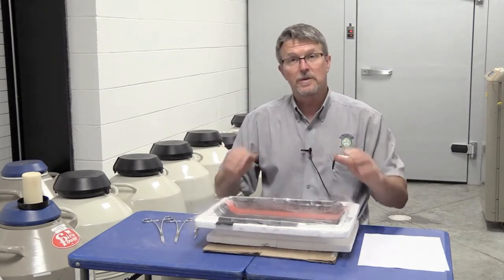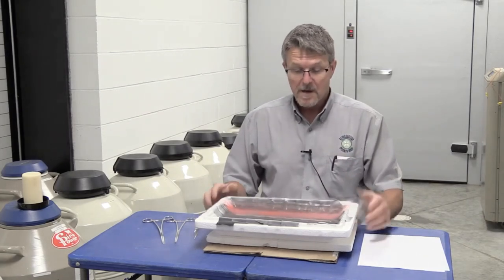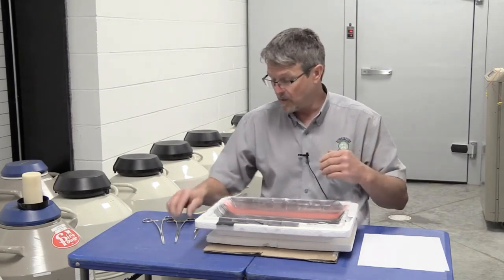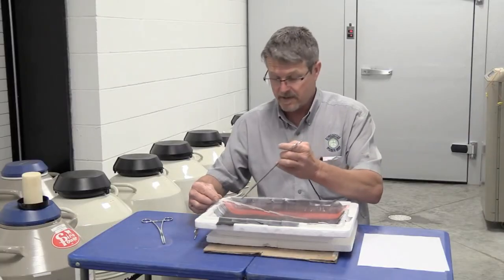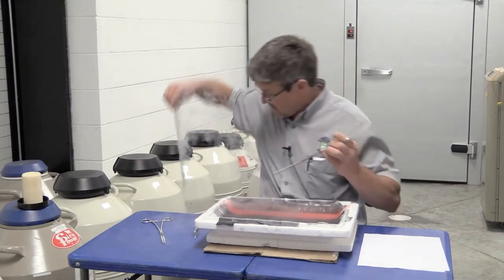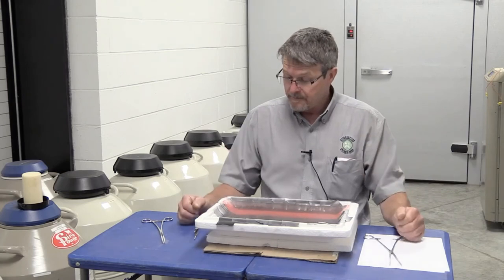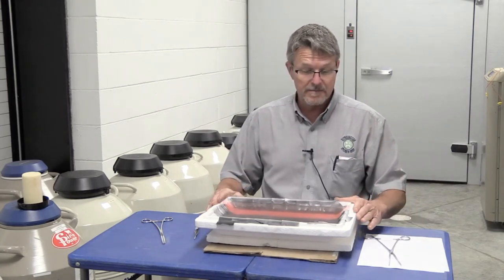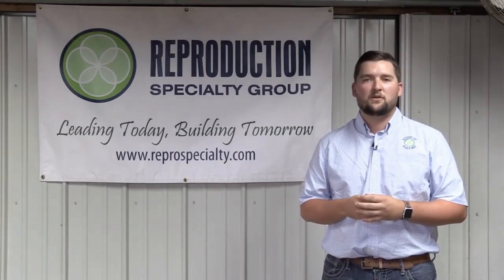Everything we've done is under liquid nitrogen, and it's clear enough that I can read the straws — you can check to make sure that you have the straws you want, all under liquid nitrogen. Now we're ready to go back to the tank. It's a simple process of just lifting up enough to grab the tab, not the cane itself, and it goes right into our tank. The styrofoam cooler is the easiest accessible thing we found, and this is our recommended process of splitting canes and moving straws.